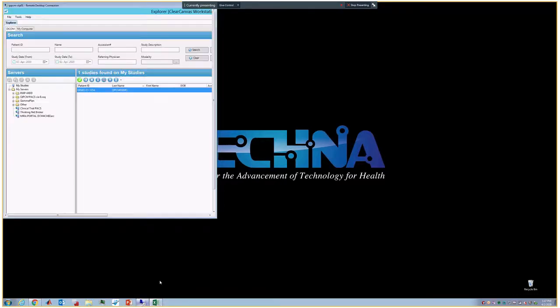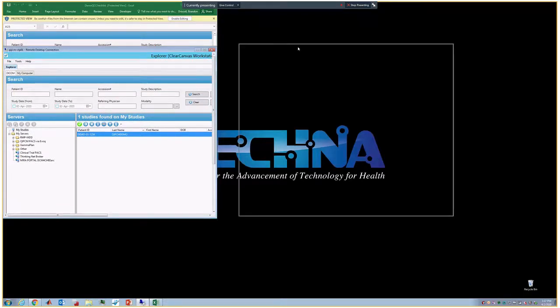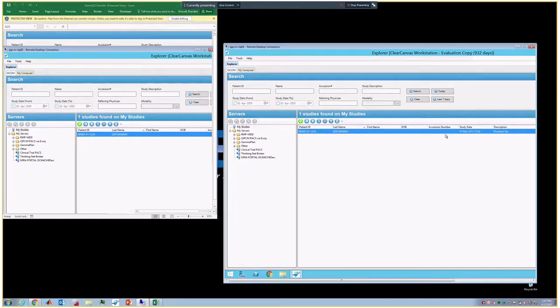I should point out, I did mention that I would have received an email as well. At the same time the site gets an email to say we've received it, I'll get an email internally, or someone in QIPCM who's responsible for these images, letting us know that the images are here and ready for QC. Normally it'll happen 15 minutes after the actual email is sent. So at this point I wouldn't have received one yet, but obviously I know I sent them.